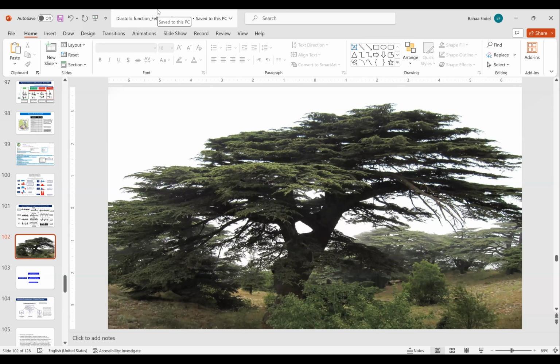The guidelines tell us to look at 3 parameters, 1, 2, 3, and that's it. Beyond the E to A ratio, obviously. E to A will make it 4, but beyond that, look at 3 parameters. But you really need to look at everything else, because sometimes these 3 parameters can be normal, or you're not sure, or you don't have a TR velocity, so you end up having only 2 parameters, and one is positive, the other negative, so you're indeterminate. There are a lot of indeterminate cases according to the guideline. That's why I showed you the other parameters, to get an idea about the patient's LV filling pressure.